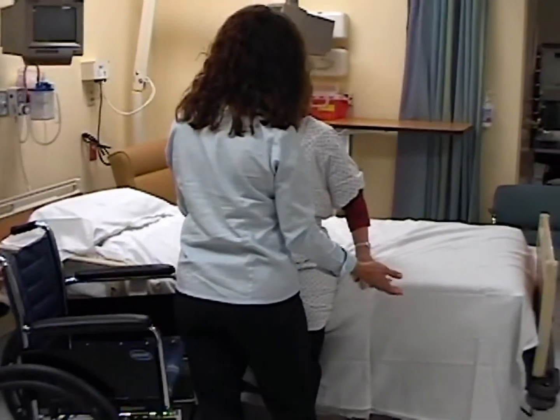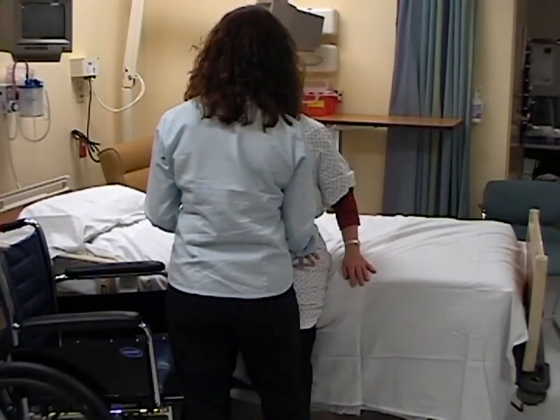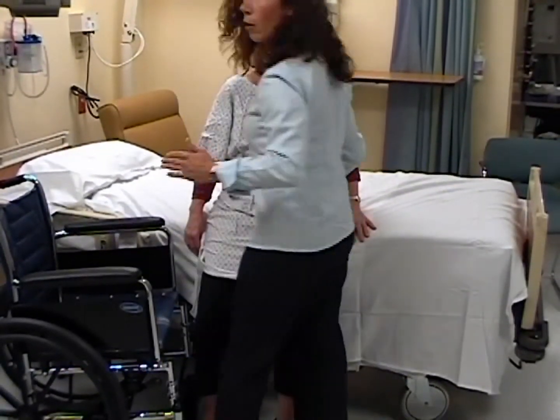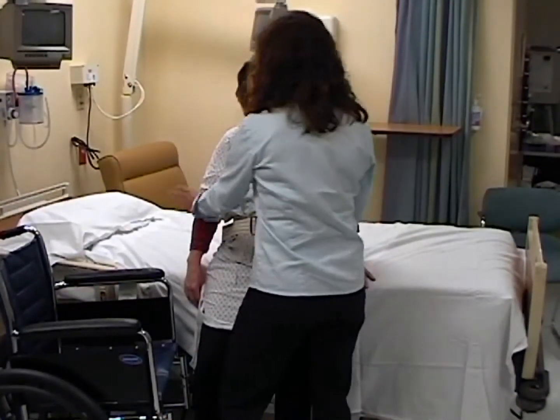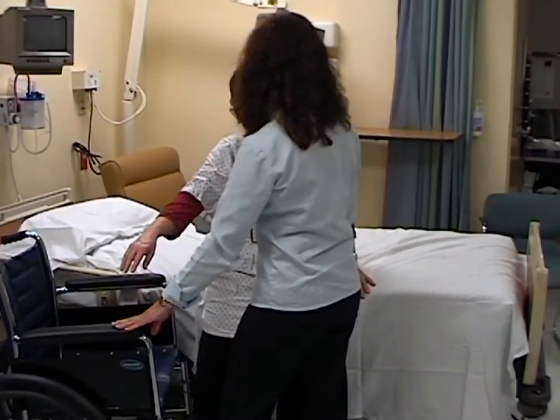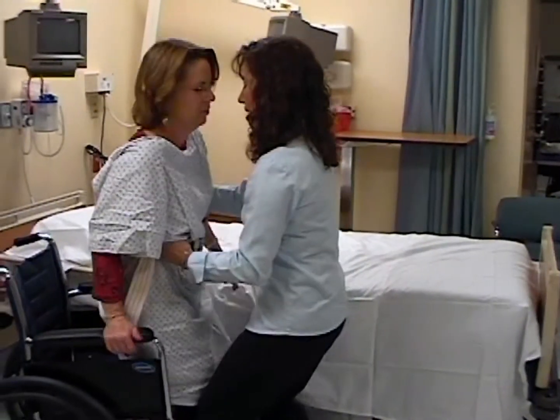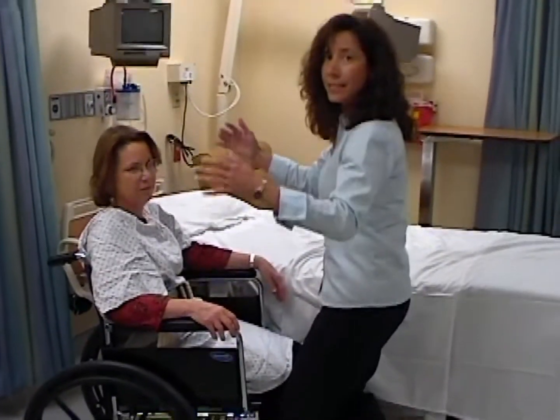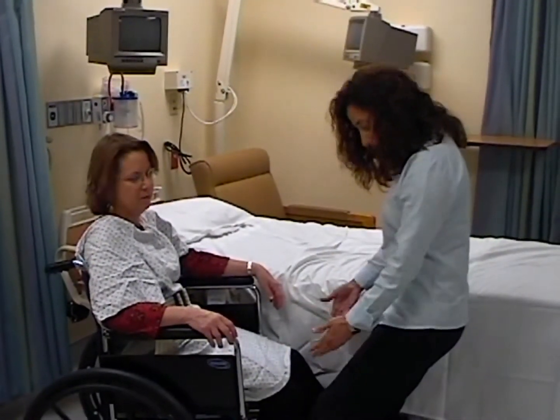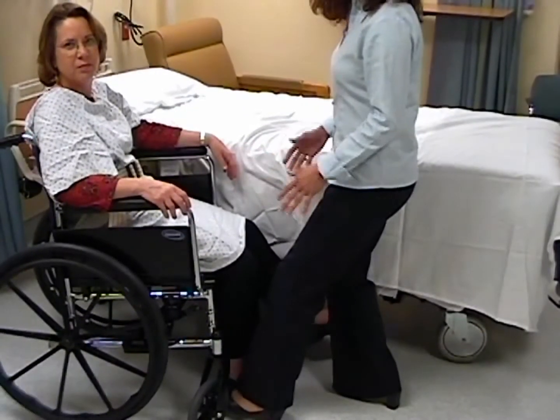If the left side is weaker, we want to put the wheelchair on the right, and we want to block the left leg with our knees. We don't want your hands to be over you. You want to instruct them to put their hand toward the armrest. Okay, ready? You can lean forward, guide them to stand, turn, and lower. See how I kept the curves of my spine and was lowering my knees. And this, where I have one knee in front of another, is called a staggered stance.